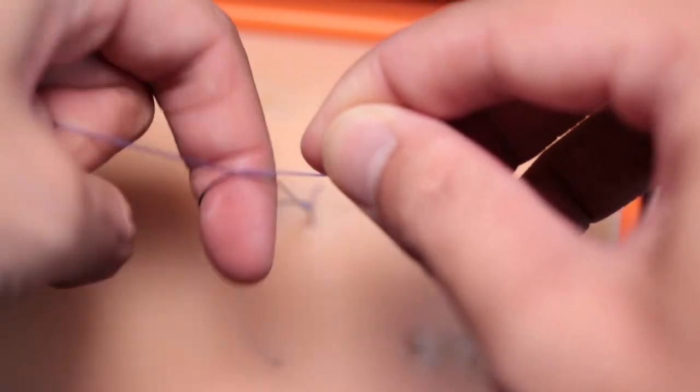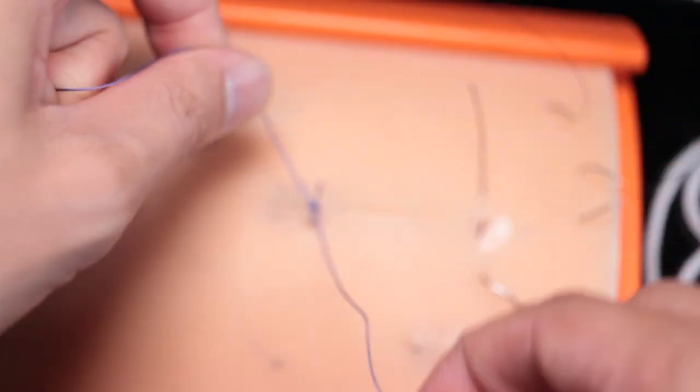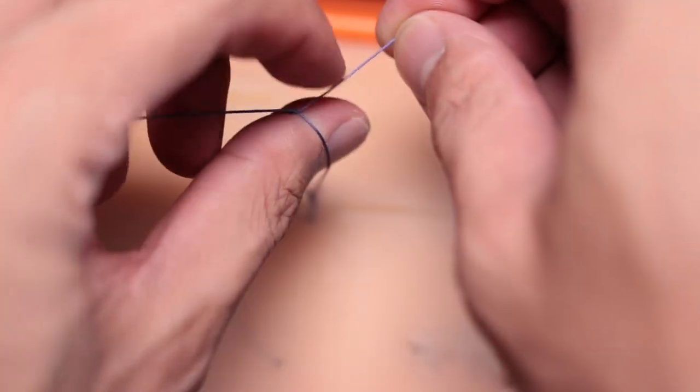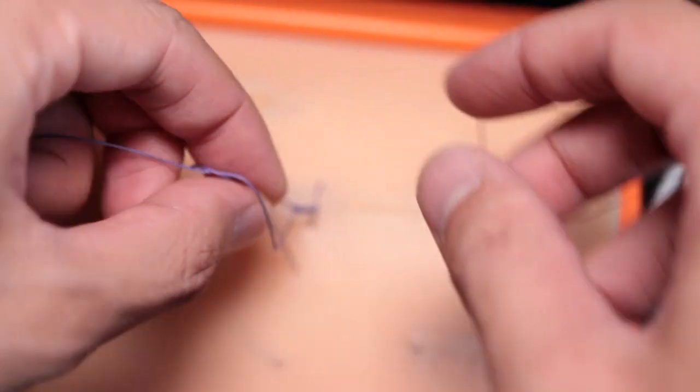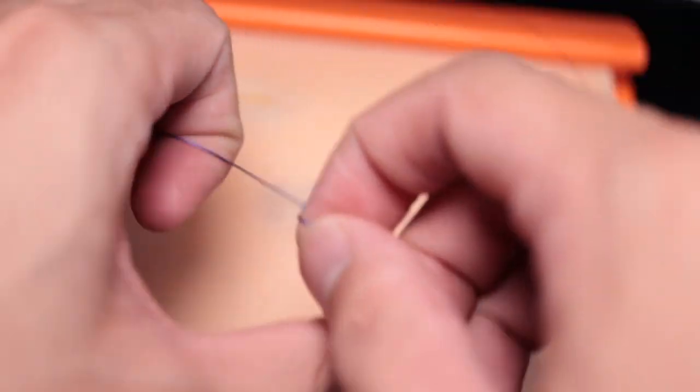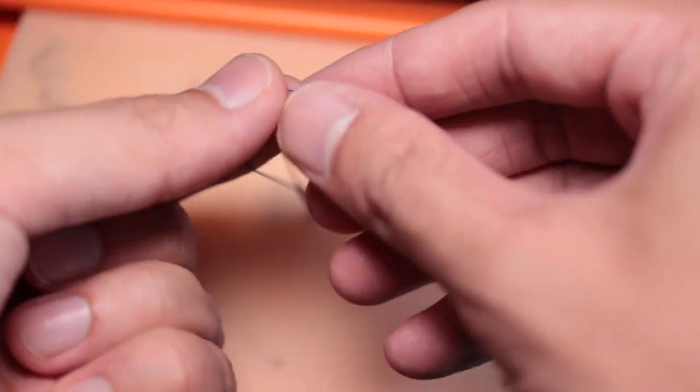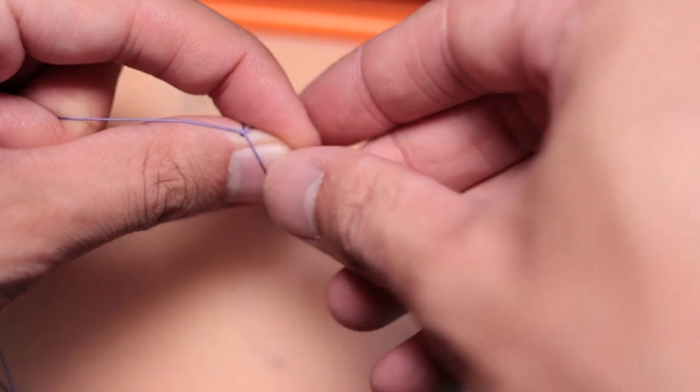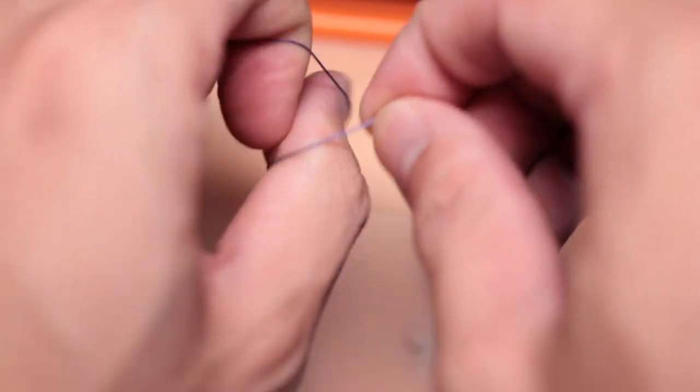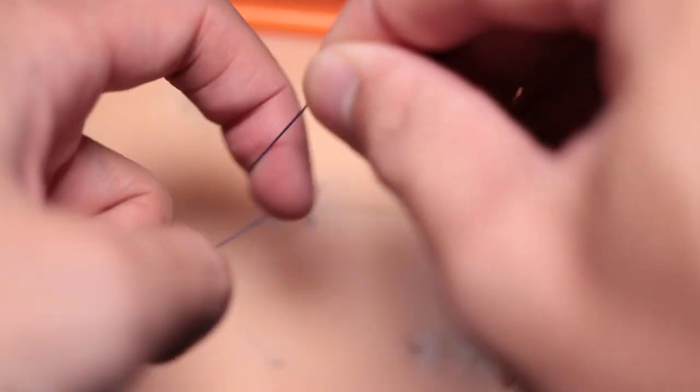Here it is with a suture. As you can see, the hands are always alternating the way they're pulling as usual to make square knots. Whichever way the free end is pointing at first, I keep it pointing in that direction when it goes under the string. That way, I'm always following whichever way I'm pulling, and the right hand doesn't have to think about which way is right for square knots.